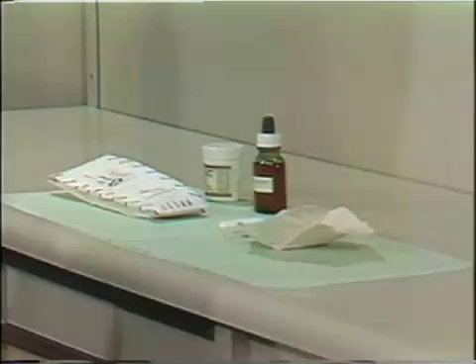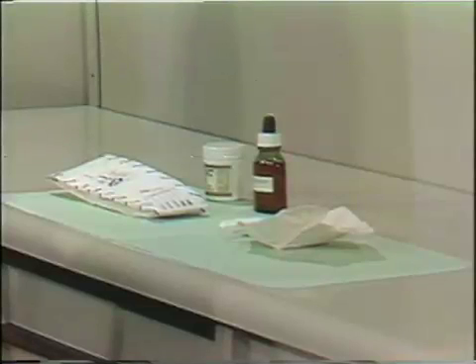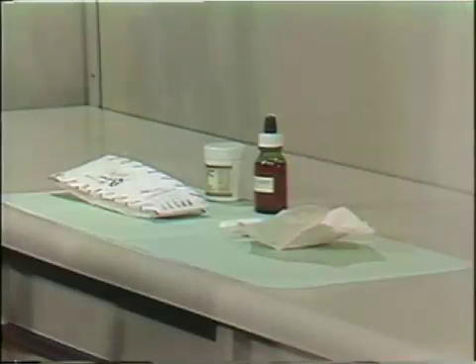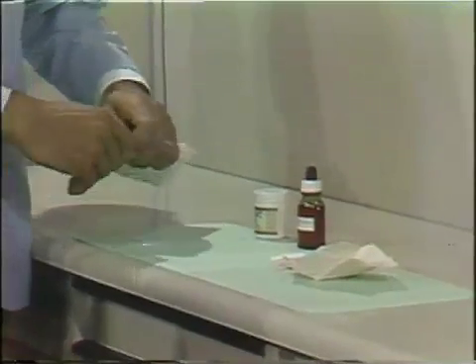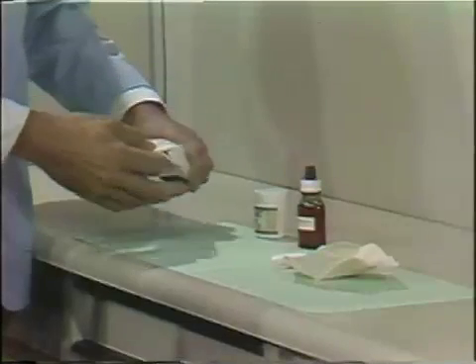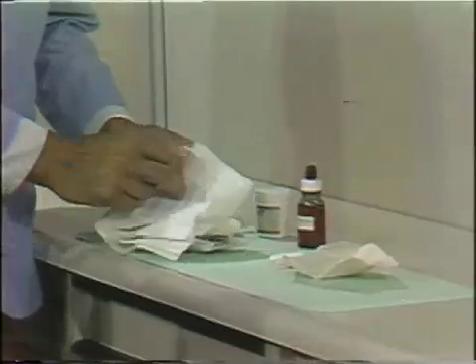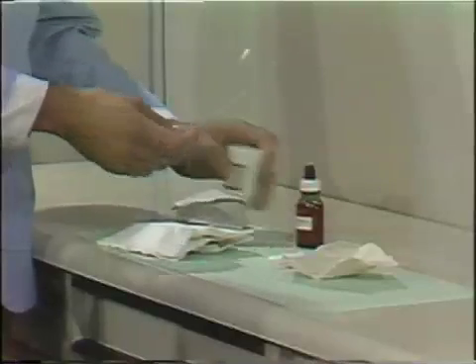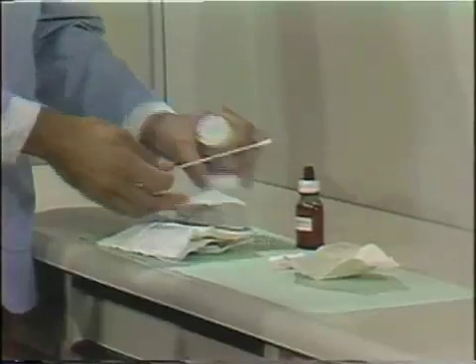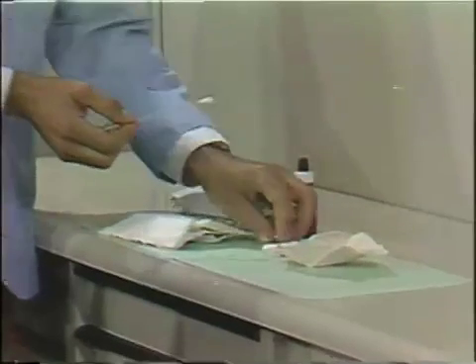When giving an anesthetic with a metal syringe, we won't cover this so thoroughly as you've all used metal syringes before. I do want to show a little bit as far as the approach to the patient is concerned. If you open this back up, as we did with the glass syringe, and get one of the cotton tips out.